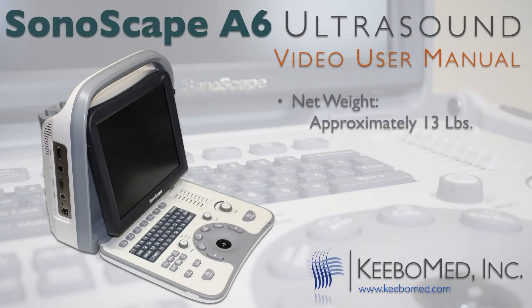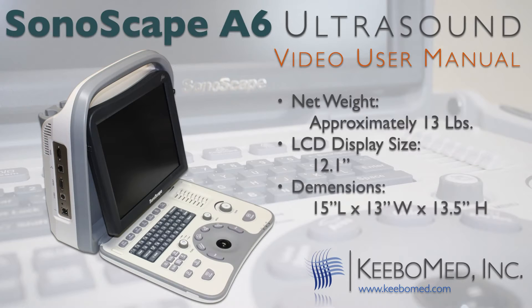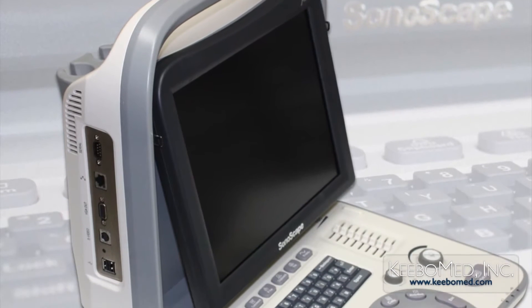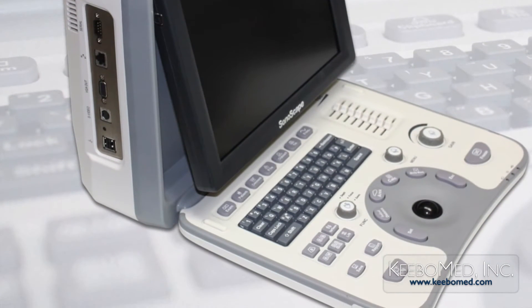The net weight is approximately 13 pounds. The LCD display size is 12.1 inches. Dimensions of the A6 while open are approximately 15 inches in length, 13 inches in width, and 13.5 inches in height.